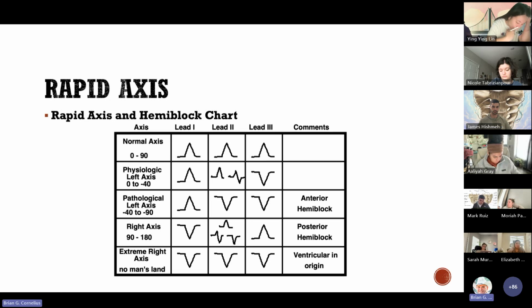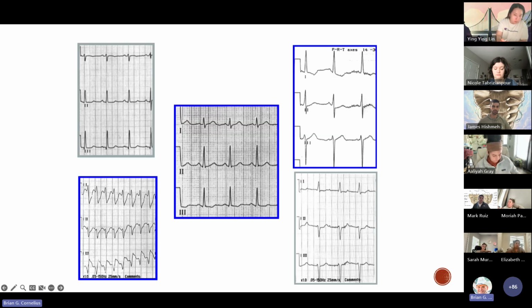Now that's confusing. Does the chart help it make sense? Okay. There's some yeses, some nos. We're going to look at some examples that'll kind of help you out with things. So as we start looking at this, if it still doesn't make sense to you, let me know.